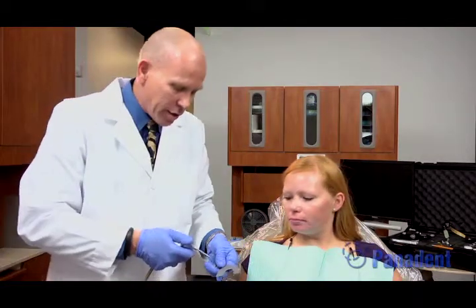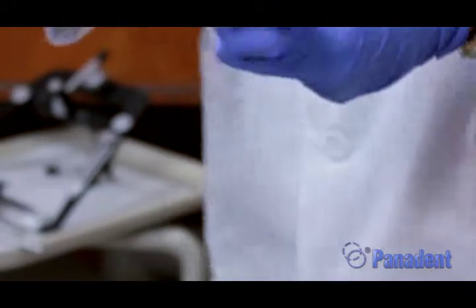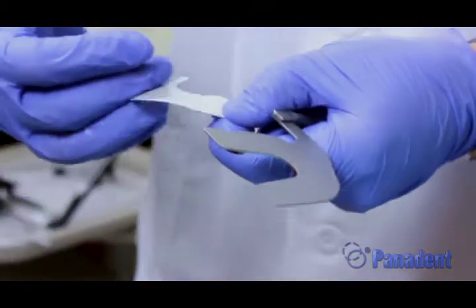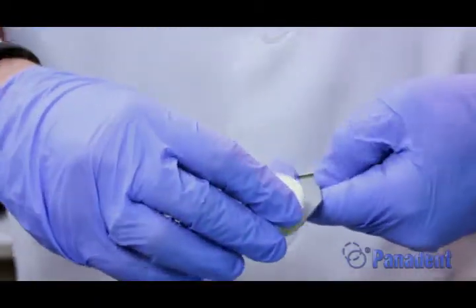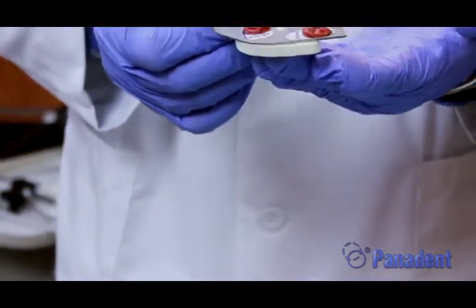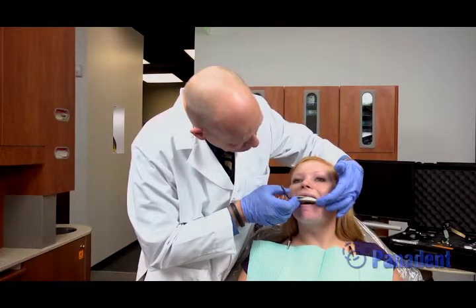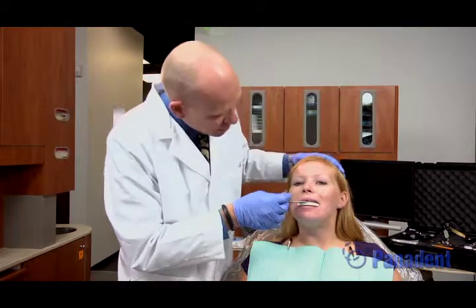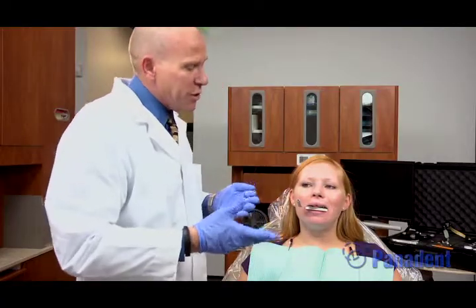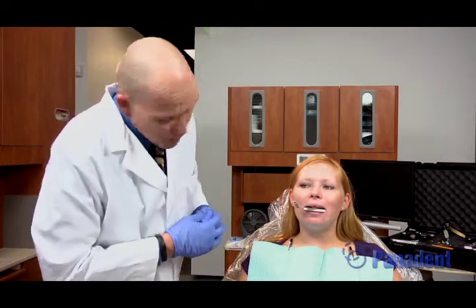We can use a little air syringe on the backside to dry this off. We do have a bite fork stabilizer — it's just a soft foaming material with a peel-off paper backing. We peel that off and stick it right onto the bottom of the bite fork. This gives something for the patient to bite up into to help support the bite fork against their upper teeth. Place this back in — seated correctly, bite up. It does not move when she bites up, and when you move the stem, the head moves. There's no flexion in the bite fork. If there is a little flexion, you may want to reline it with a ZOE paste or some material to make it more accurate, but this looks pretty good.